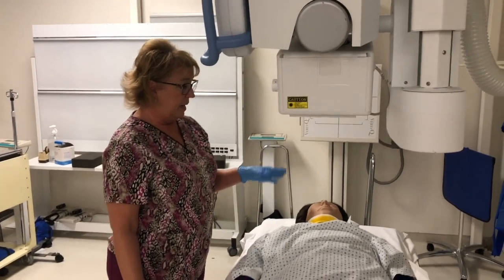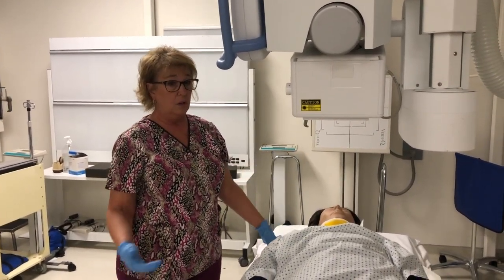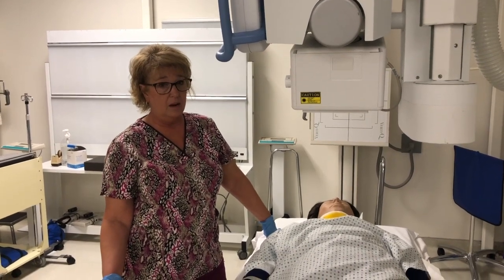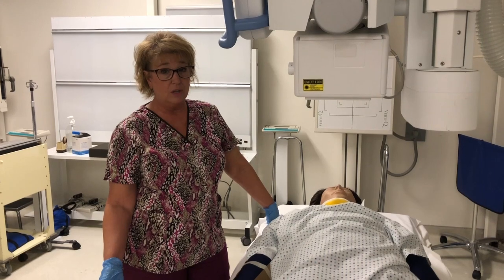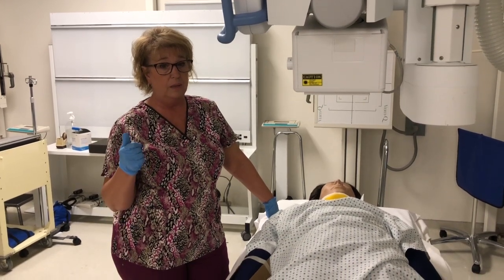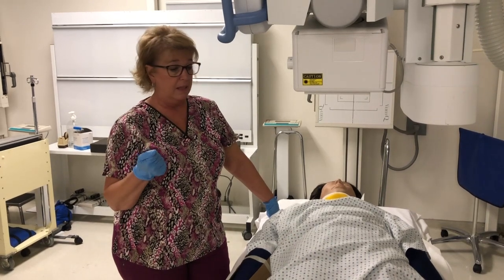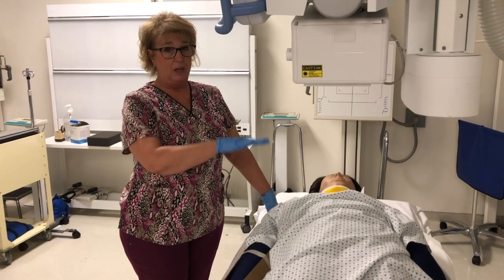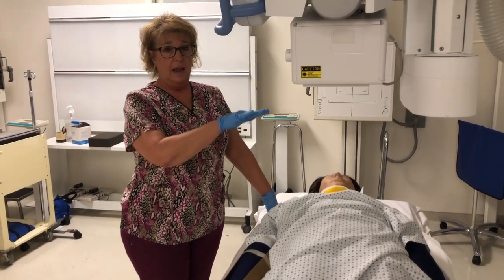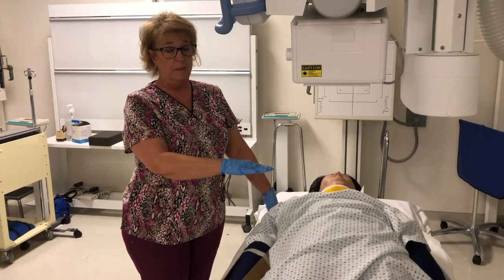Also, many times trauma patients are unconscious or have an altered level of consciousness, and they cannot cooperate or understand breathing instructions. So it's important to use a really low time so that you can capture between breathing. And so I would go behind the panel and I would watch this patient's respirations and try to capture it during the least amount of movement.